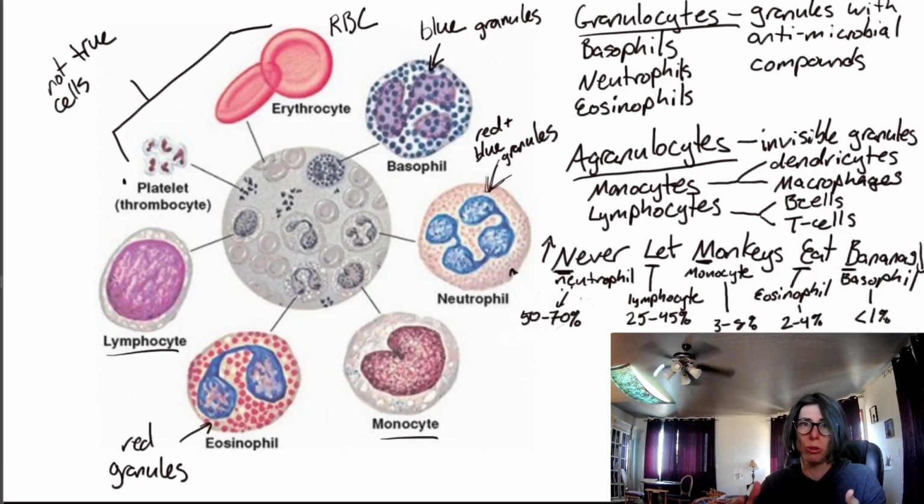Neutrophils, neutro meaning neutral, they're in between acidic and basic, and so both dyes stick lightly to them. And so that accounts for the different colors. The acid dye is pink. The basic dye is blue, and then the neutrophils pick up both of those, giving them a lavender look. All right, so let's go on to the next image here.